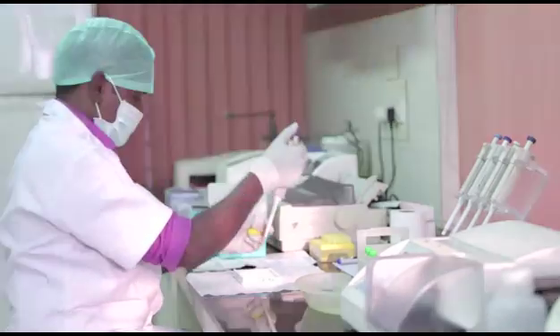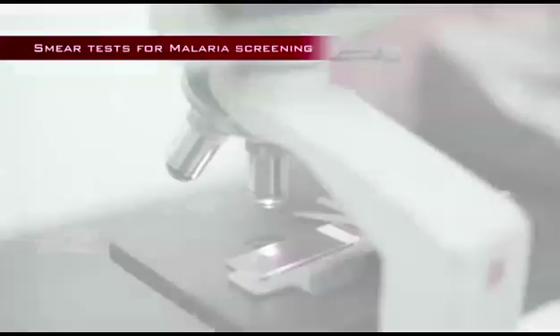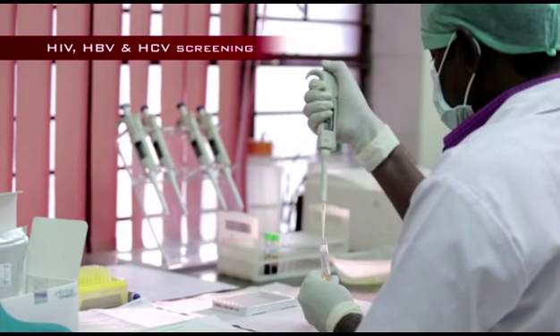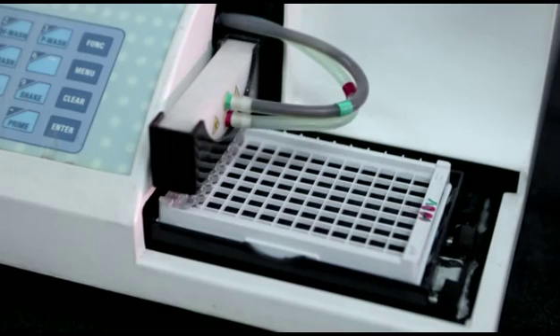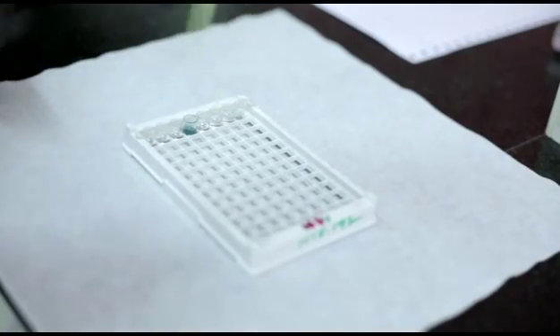This video describes the ELISA and rapid testing methods for HIV, HBV and HCV screening, smear tests for malaria screening, and the RPR test for syphilis screening. HIV, HBV and HCV screening: HIV, HBV and HCV are routinely screened by ELISA tests, which detect anti-HIV antibodies, HBV surface antigen and anti-HCV antibodies.